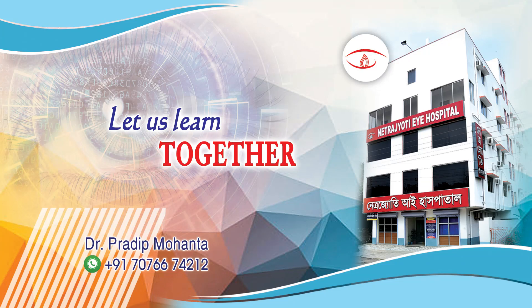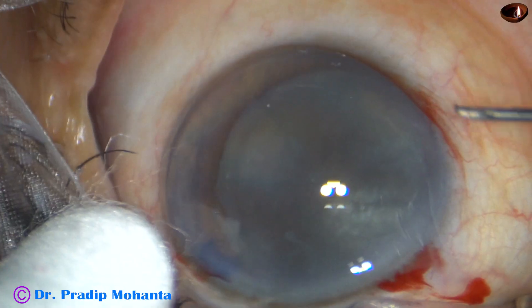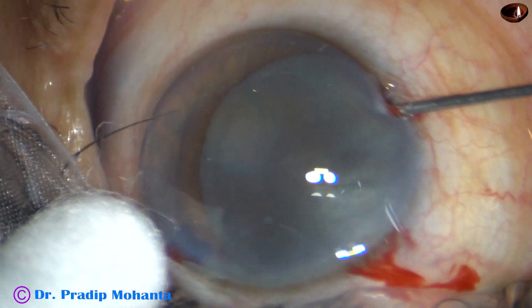Friends, in this video I am going to show two cases of heart nucleus management. This is the first case: nuclear sclerosis. In this case, it is about grade 5.